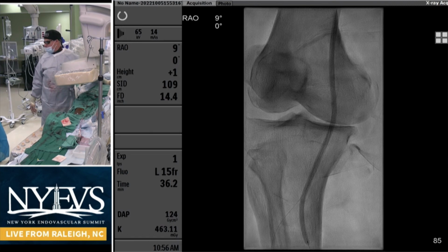Awesome, great. So what we're going to do is, just for the definitive therapy, George, what's your thought process on it? Because we'll be running short on time and we have to take a quick 5-minute break if we go to the next live case. But once you have all the balloons and everything in place, what's your definitive treatment strategy here?